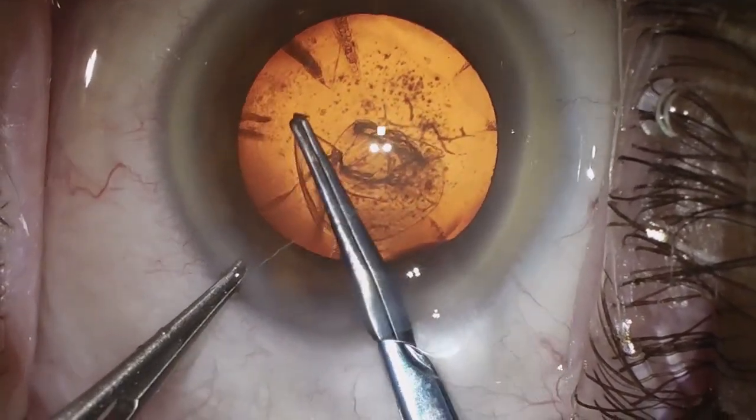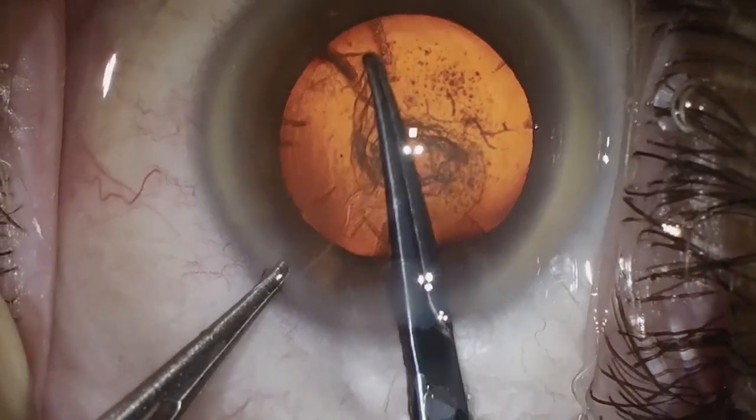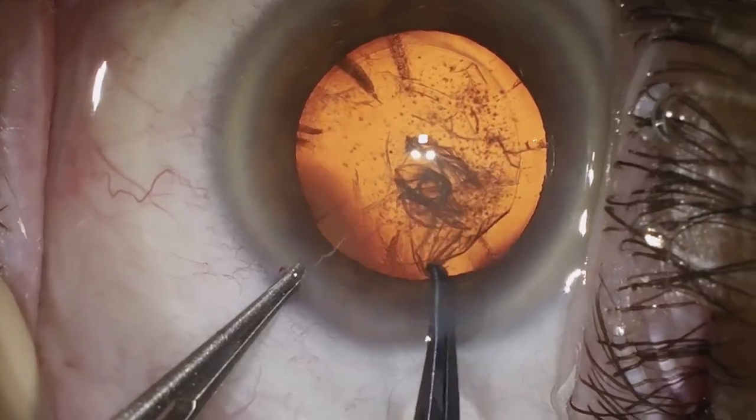We're completing here the capsulorhexis, a continuous curvilinear capsulorhexis. We started out with a cystotome. We raised the flap with one continuous motion. Things are going well in this patient's surgery.